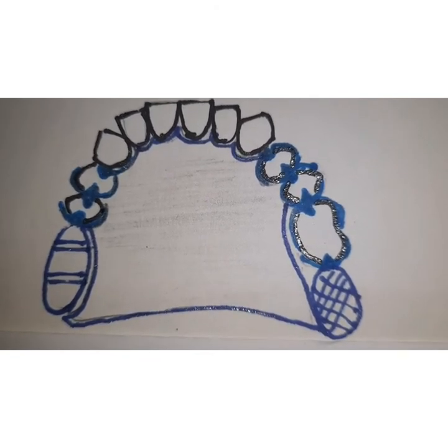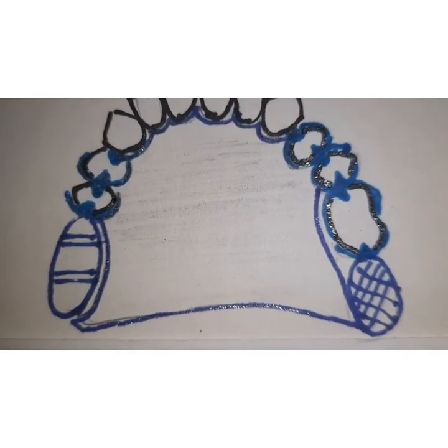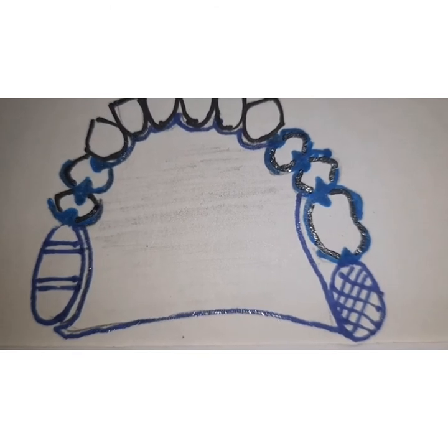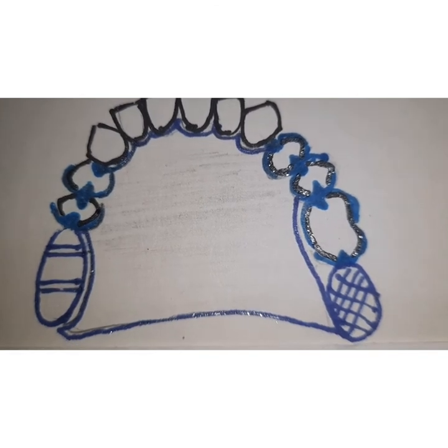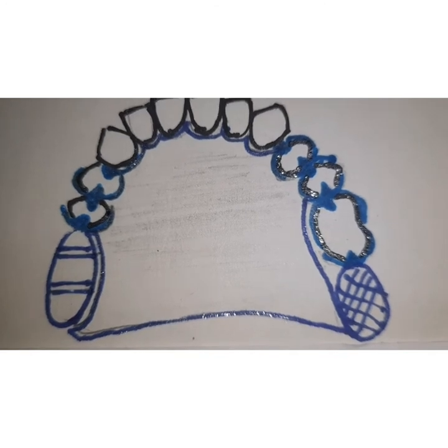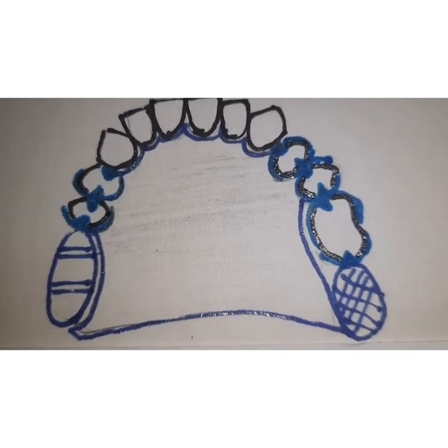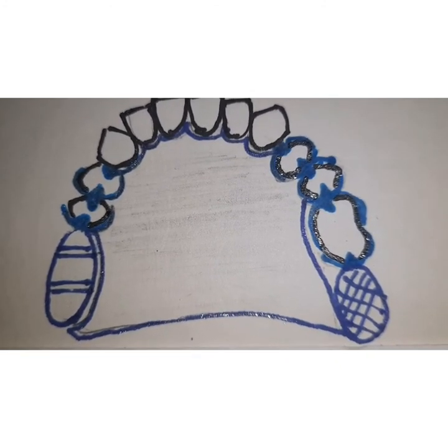These prostheses contain multiple guide planes, multiple rests, clasps, a rigid major connector, and minor connectors — as you can see in the figure, there are multiple rests and multiple clasps. The design is based on the rationale of providing broad stress distribution. Stress is distributed through the rigid major connector, minor connectors, and the multiple clasps and rests, which in a periodontally compromised dentition helps distribute stress over a wider surface area.